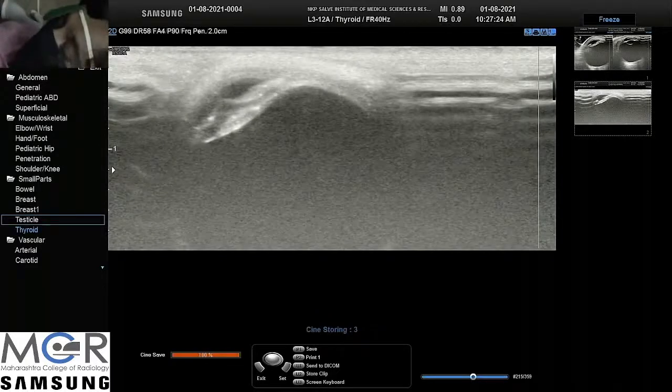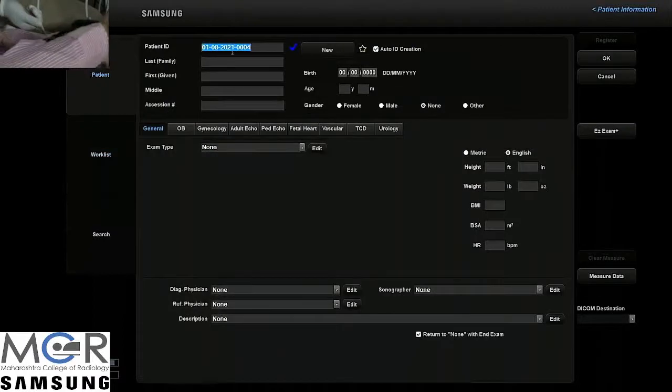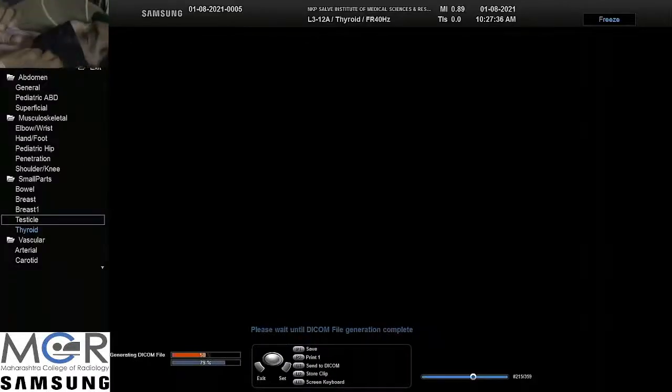We have a case of a 54-year-old male who gave an alleged history of trauma to the right eye while working in a factory 1 month back. On clinical examination, the patient was diagnosed to be a case of foreign body in the right eye.